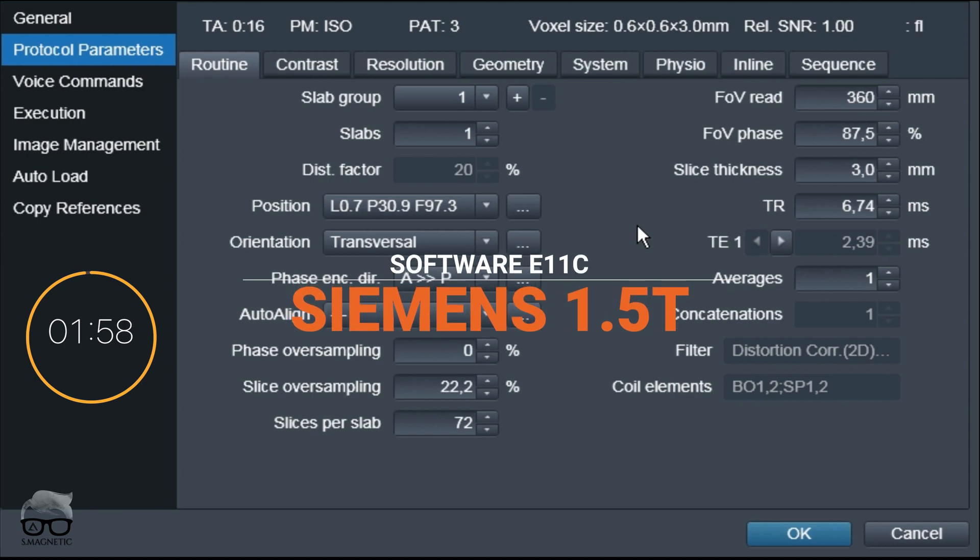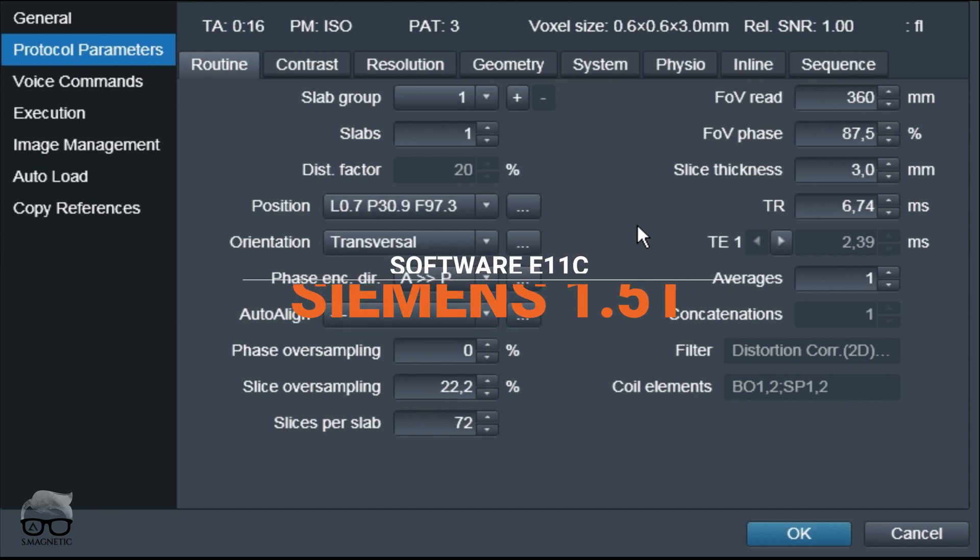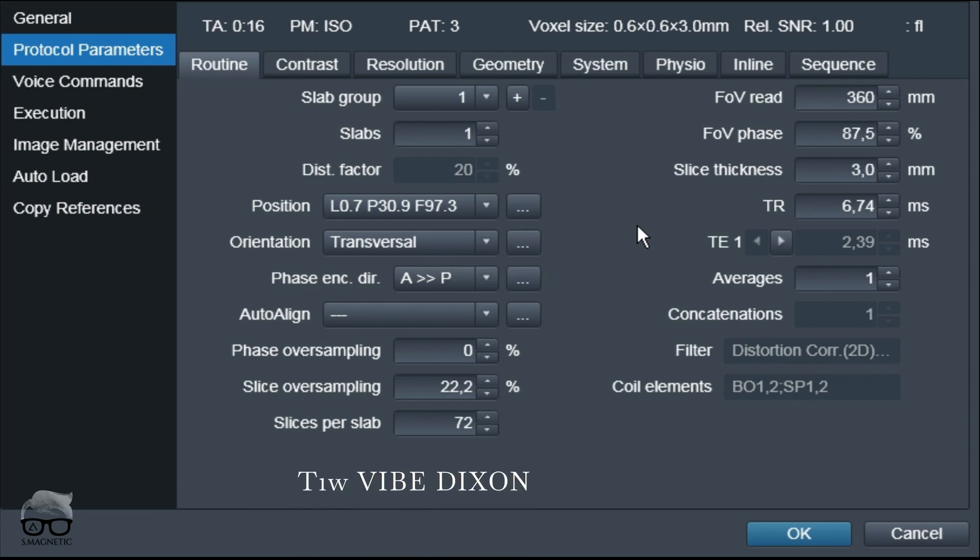All right, we are live at 1.5 Tesla, but this works the same on 3T. So these are the parameters of our T1 VIBE Dixon as you can see in front of you here. What I changed is only one thing — from having this Dixon swap to not having the swap.